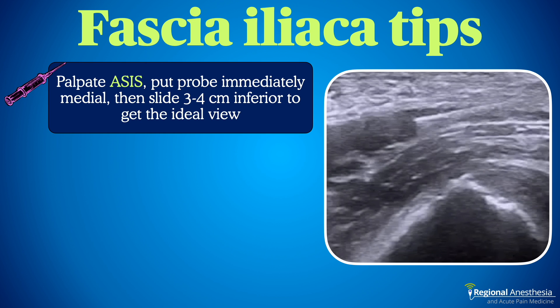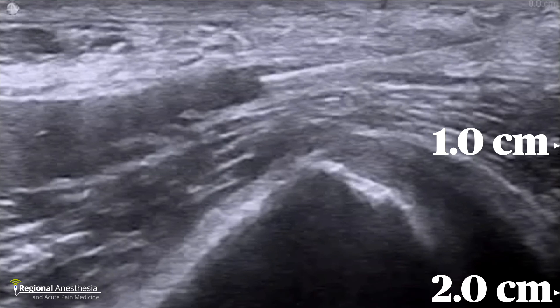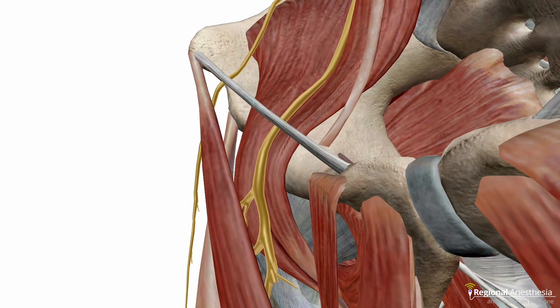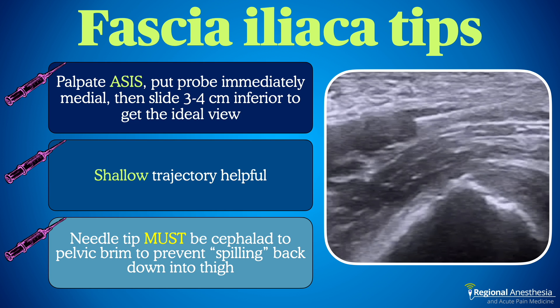Here are some SIFI tips. There are several descriptions of how to achieve the correct starting image — bow ties and other soft tissue landmarks — but these can be deceiving, especially in obese patients. Bones don't lie: use your fingers to palpate the ASIS, then place the probe immediately medial to that; sliding the probe a few centimeters south will bring the pelvic brim into view. A shallow needle trajectory is key to ensuring the tip enters the correct fascial plane and doesn't wind up intramuscular — the more parallel the needle is to the probe surface, the better you'll visualize it. The fascia iliaca is not all that deep at the level of the pelvic brim, even in large patients. Finally, it's important that local anesthetic be placed cephalad to the brim of the pelvis, trapping it there via the pinch point; try hard to avoid an injection point at or caudad to the brim where local might spill into the thigh instead.